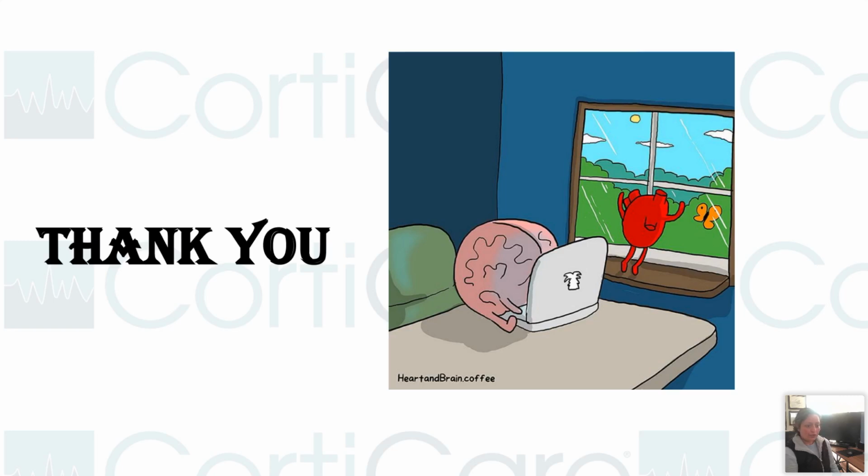How do you know if it's okay to withdraw care? Oh my God, Amanda. We are not certified to say that. I always wonder whenever I'm contacting the doctor and saying, hi, the patient is having highly epileptiform discharges and the background is suppressed, and then you would see the patient is in myoclonus, right? They are having these continuous jerks and it's basically status. And the MD will say, I don't want to get informed. So at that time, you would start thinking, oh my God, are they not worried about it?